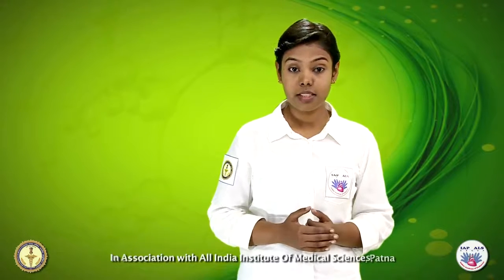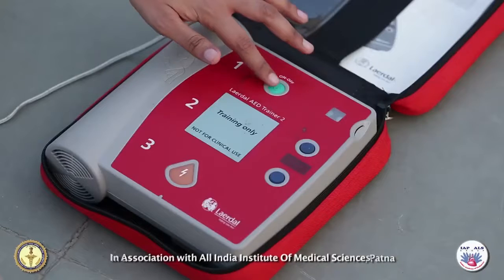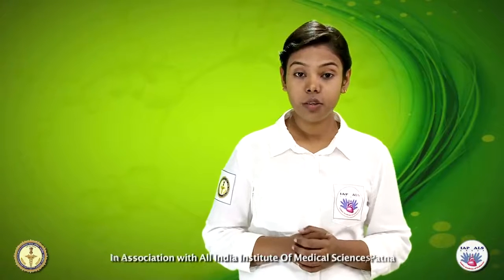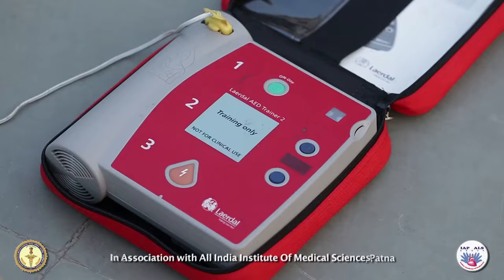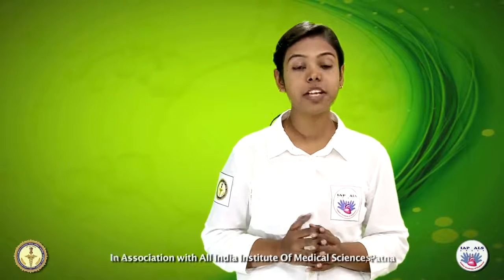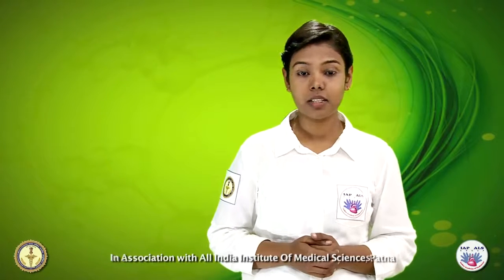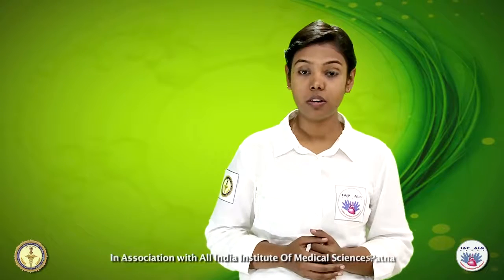Let us now summarize the steps to operate an AED. Turn on the AED. To do this, you have to open the carrying case. Then you have to carefully listen and follow the AED instructions. Press pads firmly to the patient's bare chest. The AED will instruct you to apply the pads on the patient's bare chest at a specified position. Some AEDs may have adult and pediatric pads. Adult pads should be used for those who are 8 years or older.